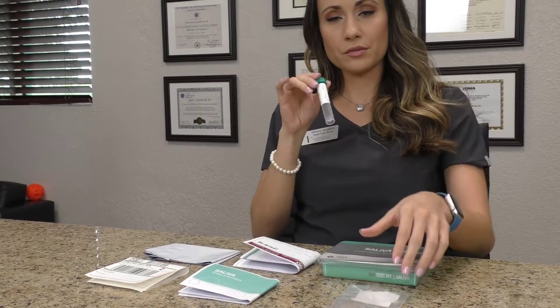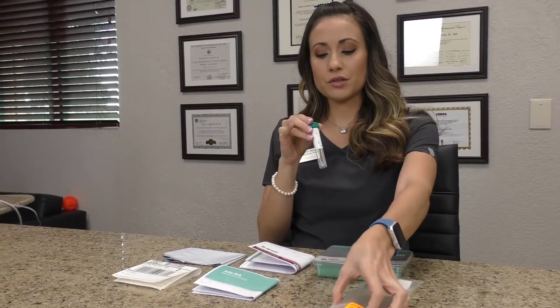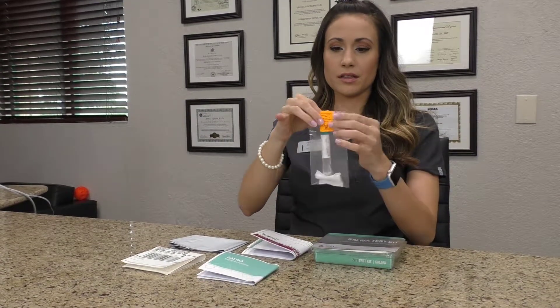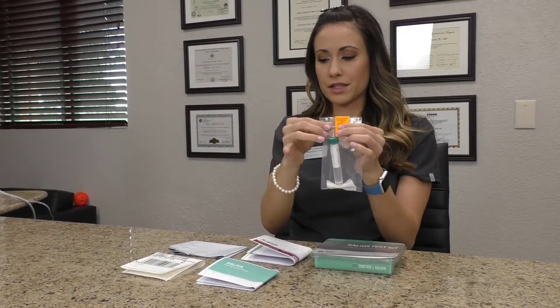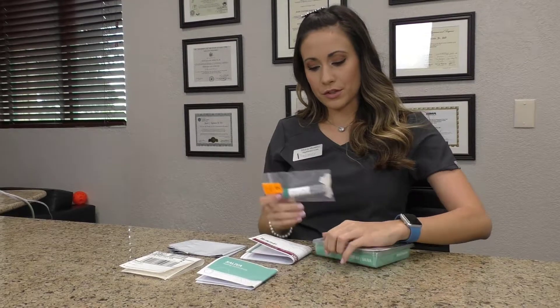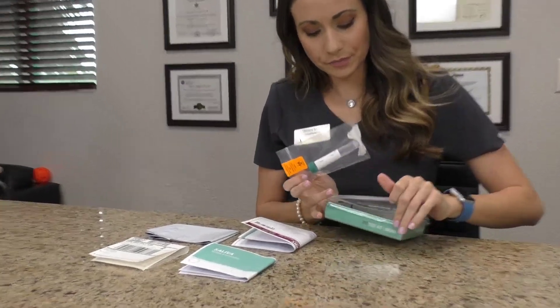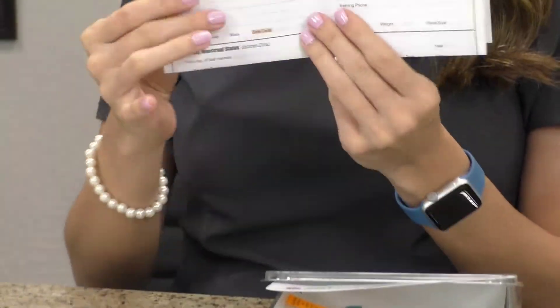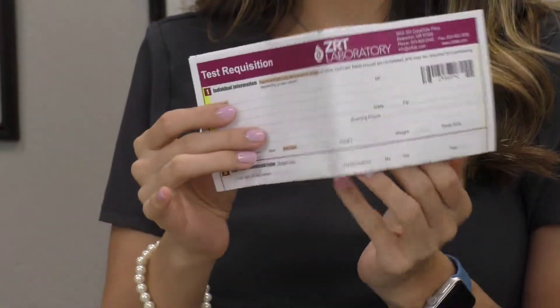After we do the sample, we're going to take it, close the tube, make sure it's labeled, and put it right into the specimen bag and close that up. Then we're going to put it inside our box.